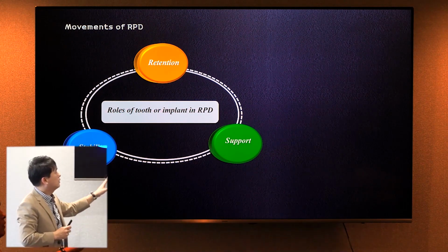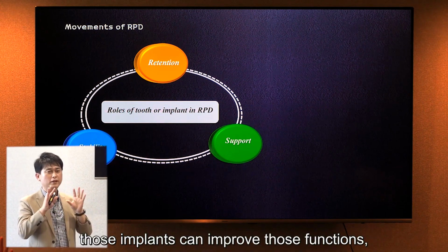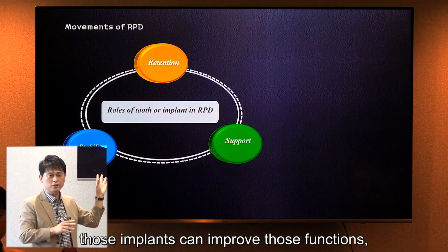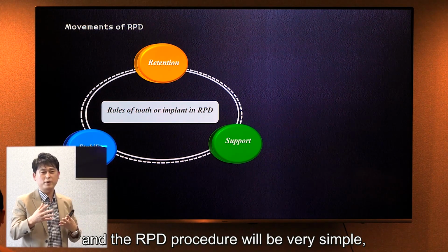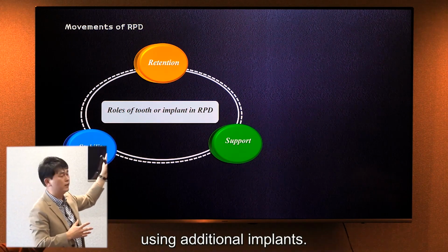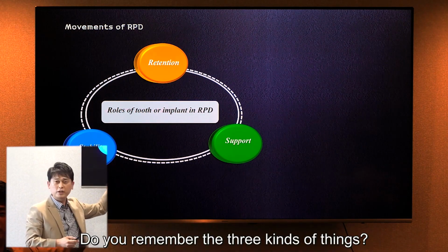If we insert a small number of implants, they can improve those functions, and the RPD procedure will be very simple. Do you remember the three things?